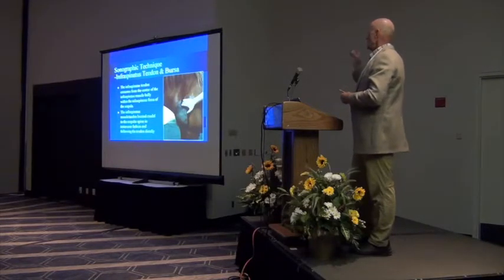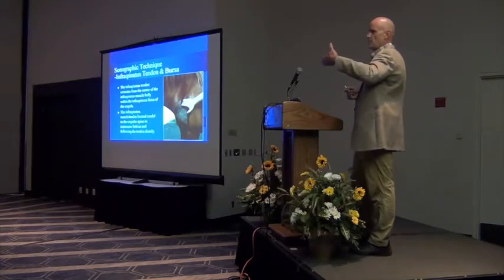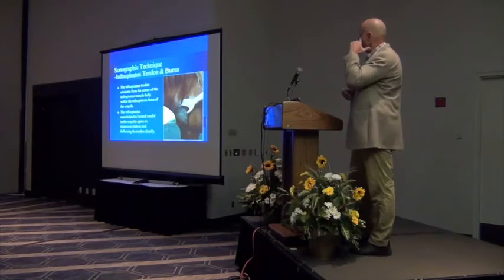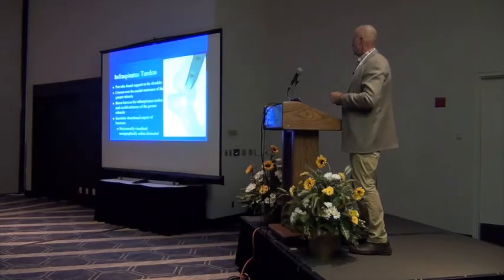And you drive the needle in pretty much parallel with the ground, 45 degrees off of lateral to medial. And I usually stuck my finger in about a thumb's breadth above that depression, and then drove it on the back side of the infraspinatus. And then you drive it until you hit cartilage.